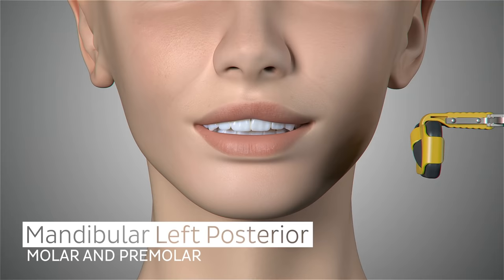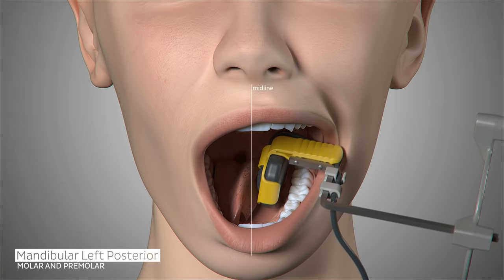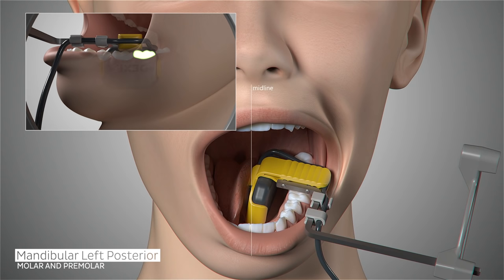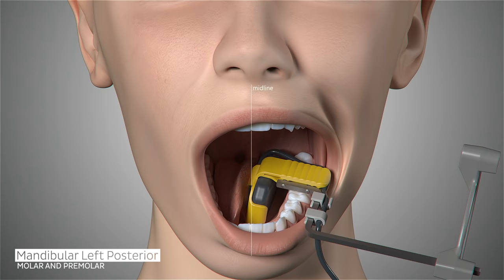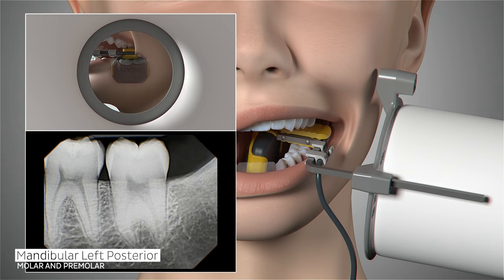The configuration of the sensor and holder does not have to be adjusted for the next image in our full series, which begins with the patient's mandibular left molar. Position the sensor so it is parallel to the roots of the teeth in the occlusal line, centered on the second molar. Place either next to or over the tongue, whichever is most comfortable for the patient. Ask the patient to relax and close. Slide the aiming ring as close to the patient's jaw as possible. Place the x-ray emitter cone flush with the aiming ring and trigger your exposure.